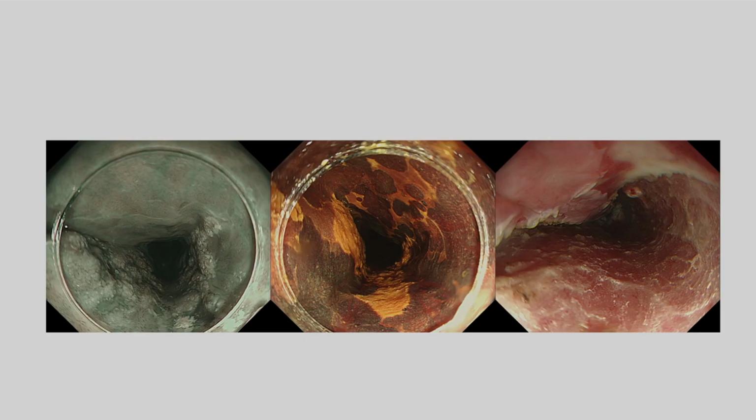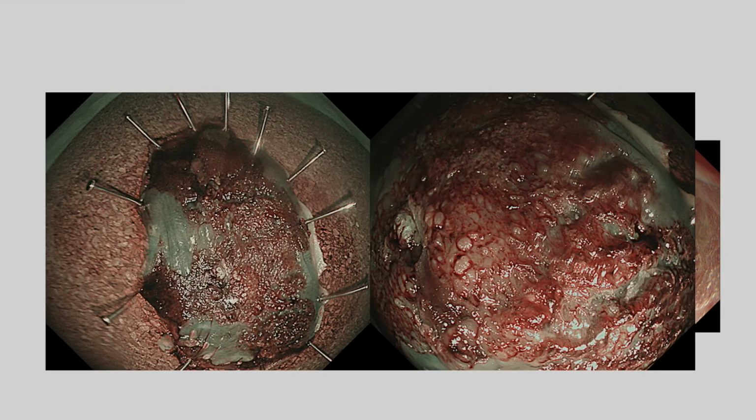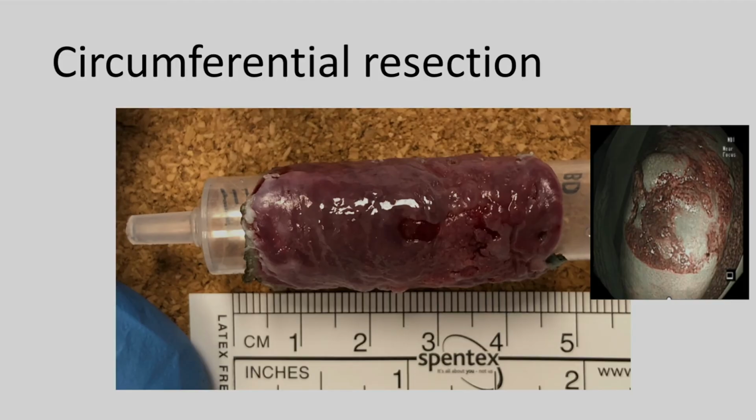This is the area which you should be targeting with ESD. This is homogeneous, there is no nodularity involved, there are no ulcers, there are no abnormal IPCLs apart from B1s and early B2s. So with the Lugol's, you've got a nicely highlighted area, and you can resect that area with ESD. Again, to highlight, when you resect the specimen, please spend some time assessing the lesion on the surface. Circumferential resections, yes, you can offer for squamous, but be very, very careful and choose the lesions appropriately.